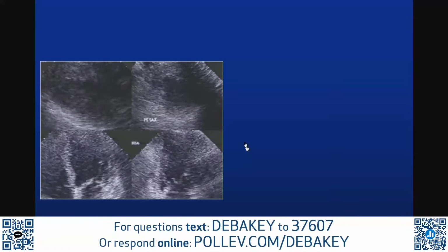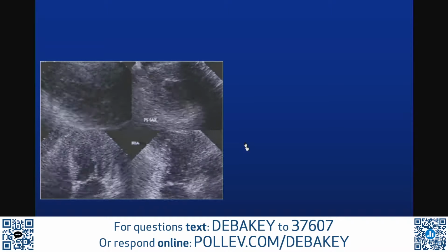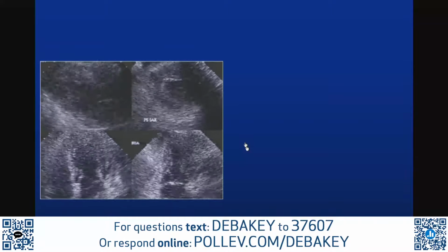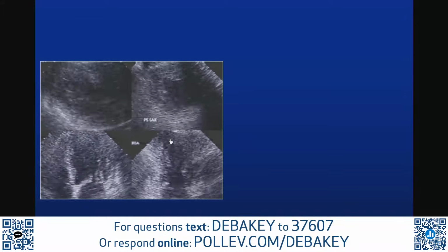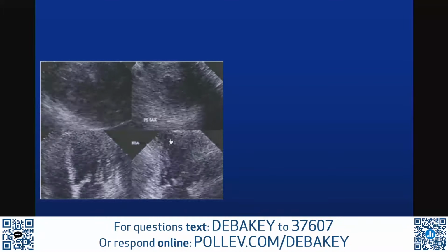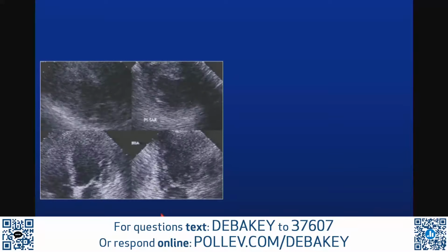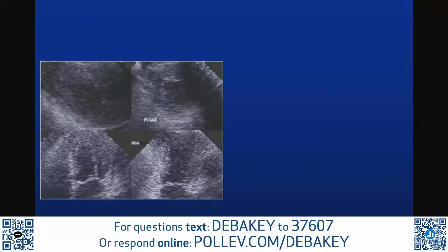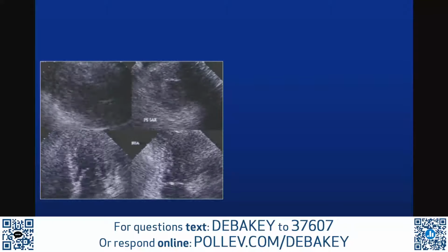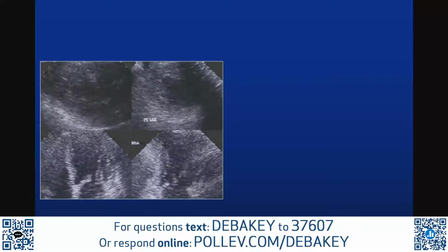This is an example that I use all the time because it's hard to reproduce. I remember I was directly involved in it, and I always say that. This is probably more than 10 years old. I interpreted the study as normal. Okay, and I'm giving you the best pictures that I can see. And Dr. Kleiman, our interventional director, said, there's no way it can be normal. The electrocardiogram shows an infarct. Can you please do something?